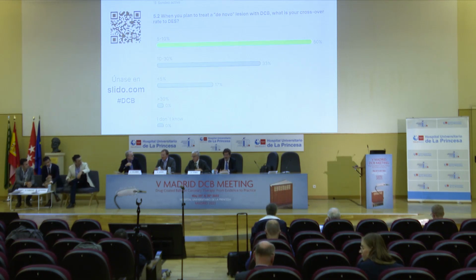I think it depends a little bit on what balloon you're using for pre-dilatation. If you just use a regular semi-compliant balloon and blow it up, then probably you have higher rates of crossover. And if you start with a gentle little inflation and then you go over to the specialist balloon, this rate could be lower, I think.